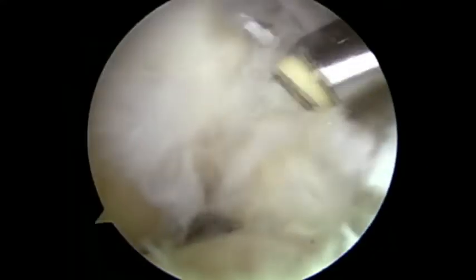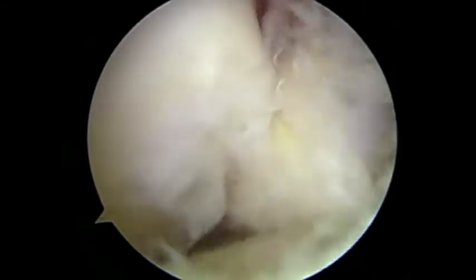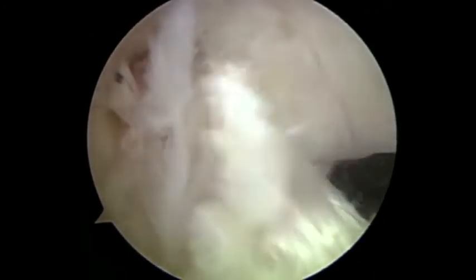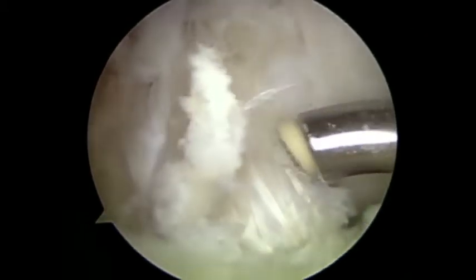We use a radiofrequency ablation procedure to debulk the ACL, starting from the perimeter of the ACL and working inwards to debulk the engorged fibres to physically reduce the diameter of the ACL.